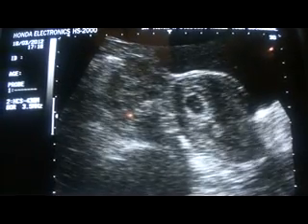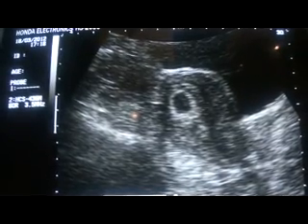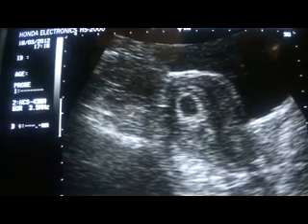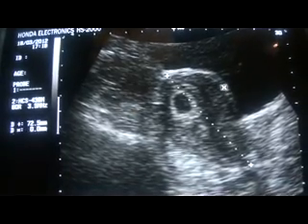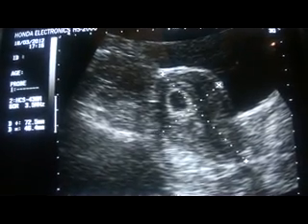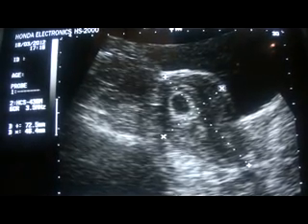Now this is the uterus in longitudinal section. This is the uterus and this is the fundus of the uterus. This is the anterior segment, posterior segment of the uterus. This is the cervix of the uterus, and in long axis we see an intact pregnancy with double decidual reaction, and this is also called trophoblastic reaction. Echogenic rim, which is not broken, is evenly echogenic.